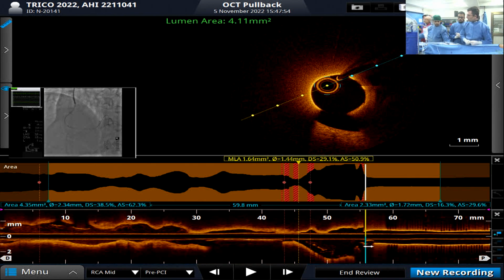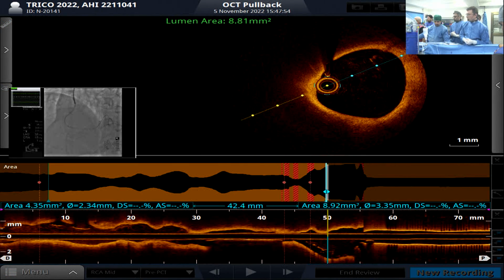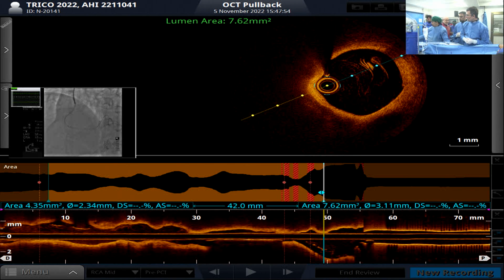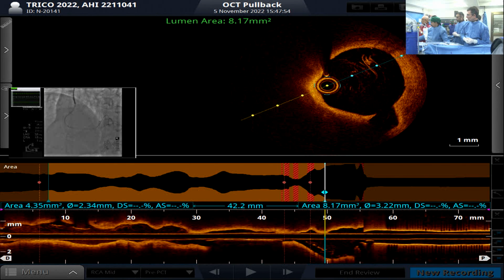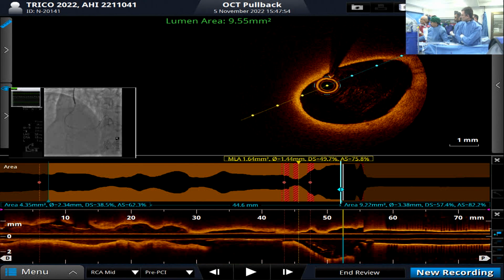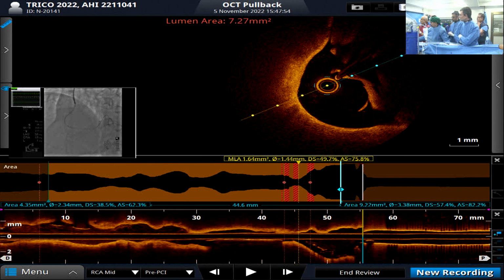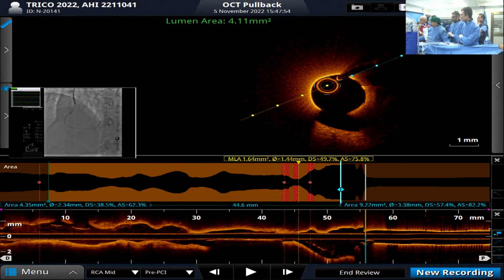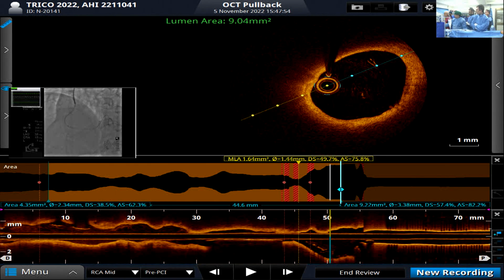Can we show the previous pictures, the angiogram? Here, I think the proximal landing is vital. There is a TCFA, we have to avoid that. Come more proximally. Come more proximally. No, still. No. No, that's artifact there. No, go in. This looks reasonable. Yeah.